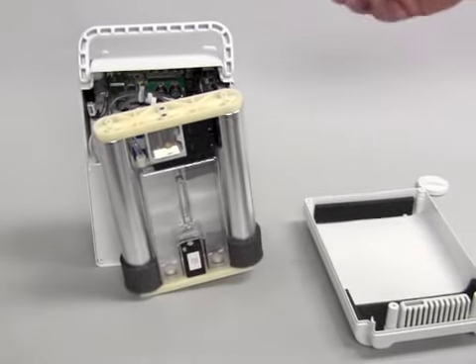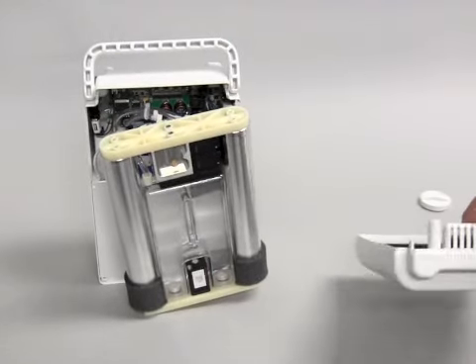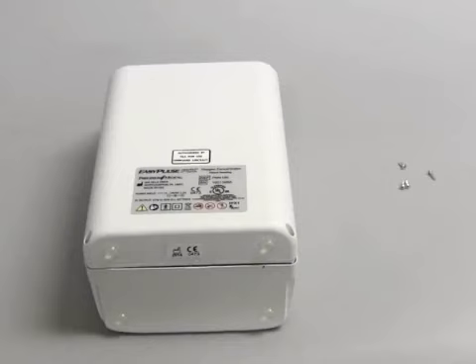Okay, this step shows that we have now put the handle back in place, right, and we are ready now to put the cover back onto the sieve bed assembly.